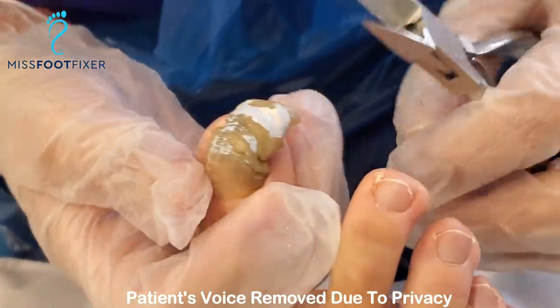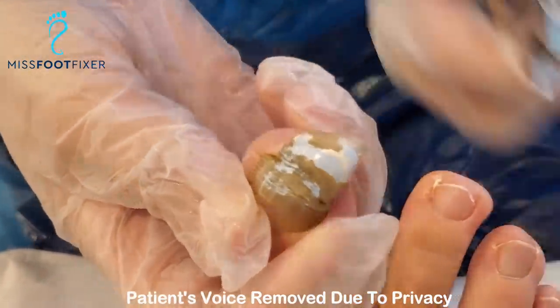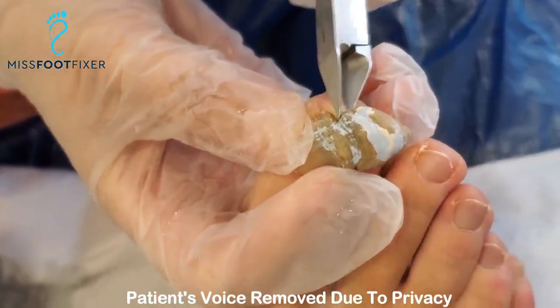There's some nice white and blue nail polish on there, which is great. Okay, so how would I cut this? I think maybe from here, on this edge here.